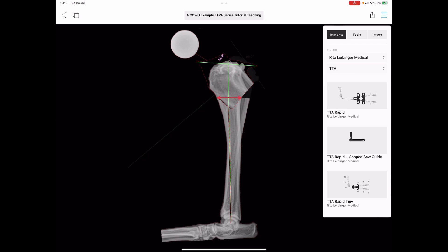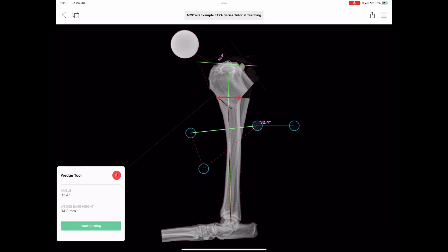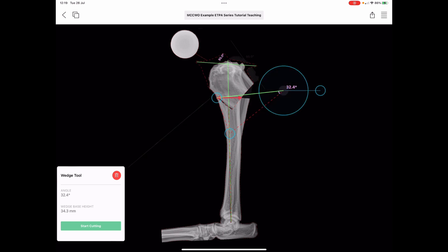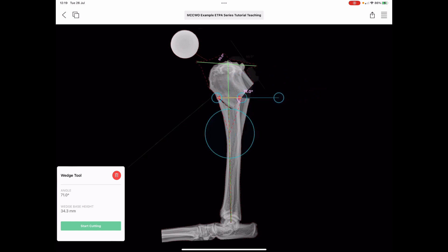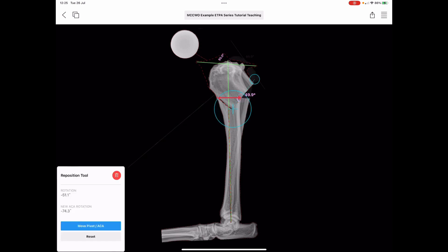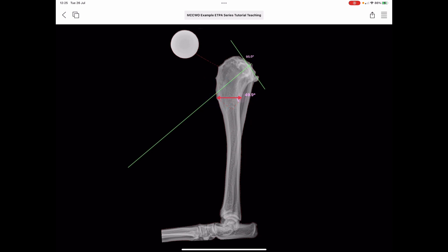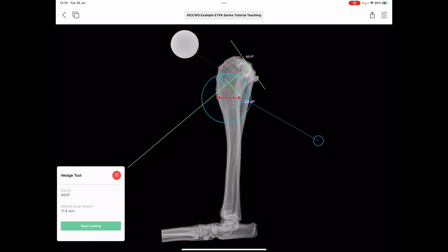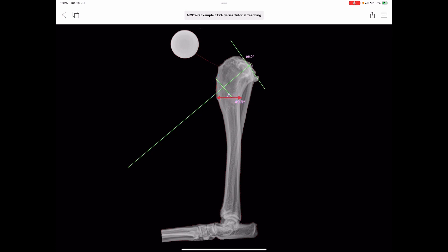Let's delineate what we want to get rid of with the wedge tool. Go to Tools in the top right, then Wedge. We can place that wedge over the area of bone we're looking to remove — in this case it's a wedge of 49.9 degrees. If we trace back to the original tibial outline, we can now reposition this wedge exactly where it needs to be, and measure its position from all our known palpable landmarks when we're in surgery.